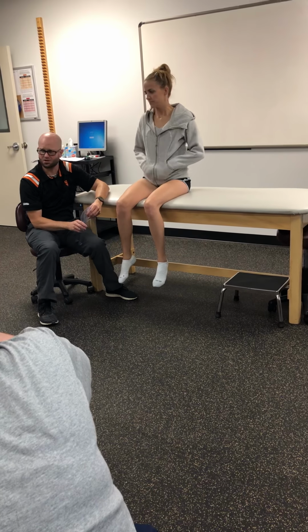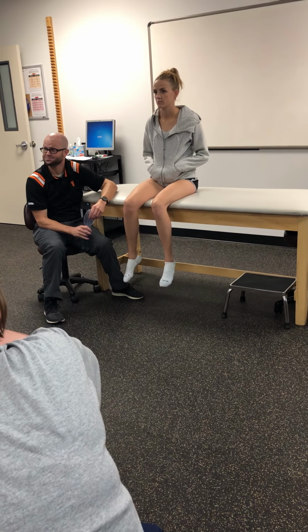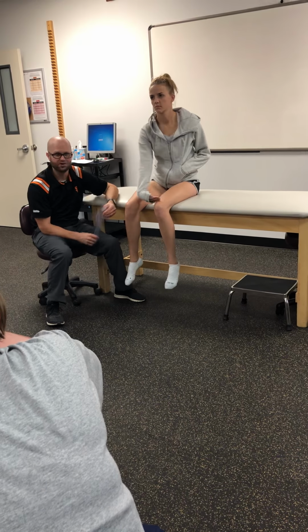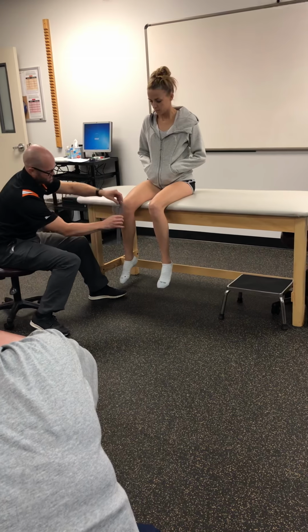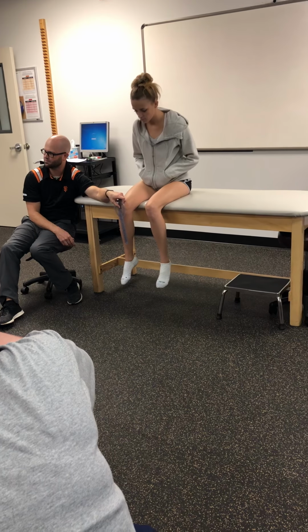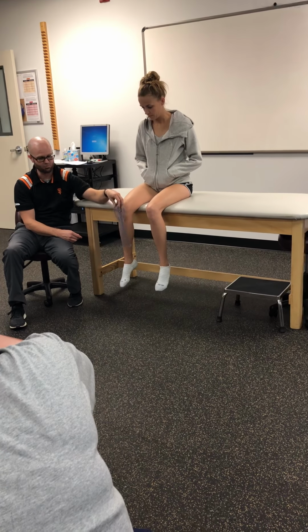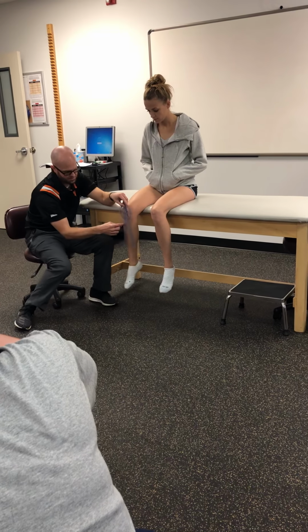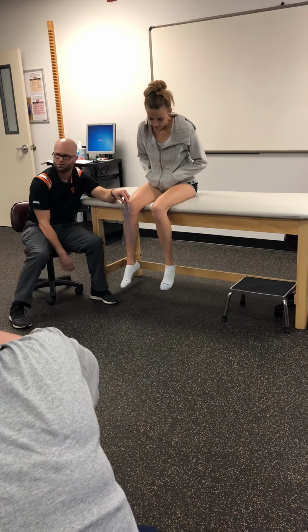Our proximal arm is going to be lined up with the other patella, perpendicular to the floor, or parallel to something that we can line up with. So in this case, I could say parallel to the table leg, or perpendicular to the floor, however I want to look at it. And then my distal arm, or my movable arm, is going to line up with the tibia. Down the tibia, and if we want to, we can just go right in between the medial and the lateral malleoli.